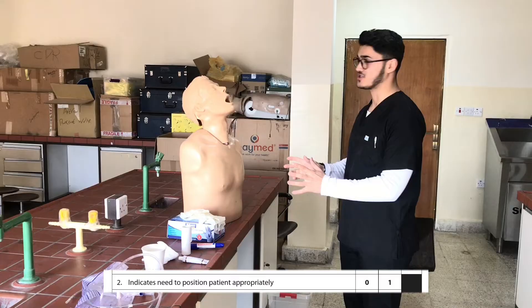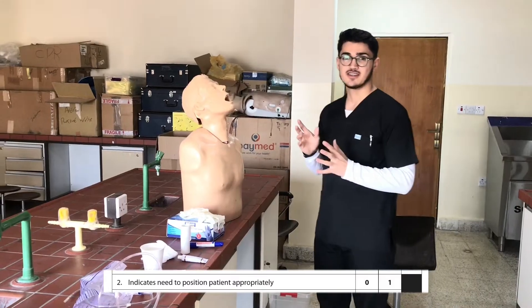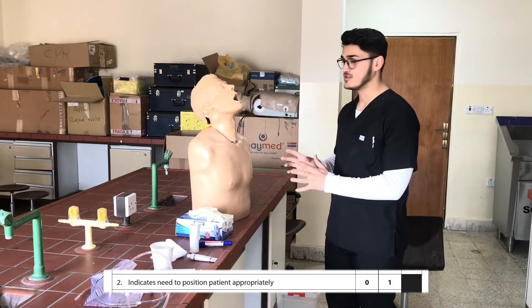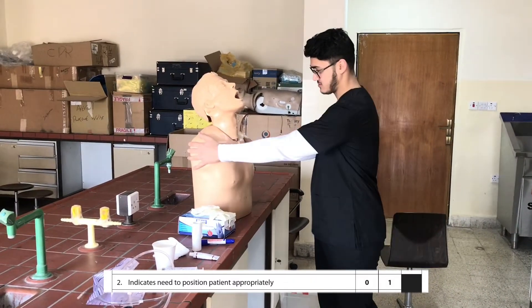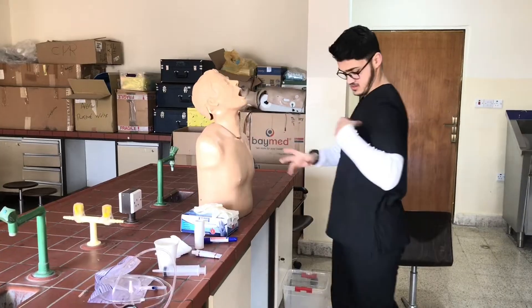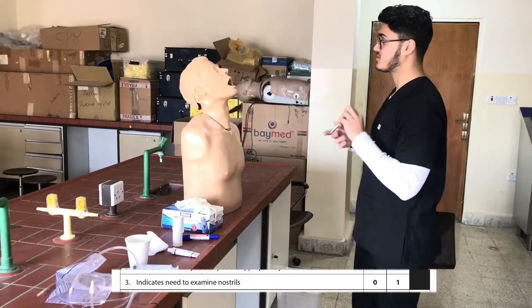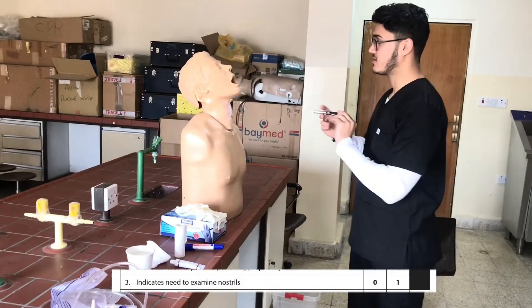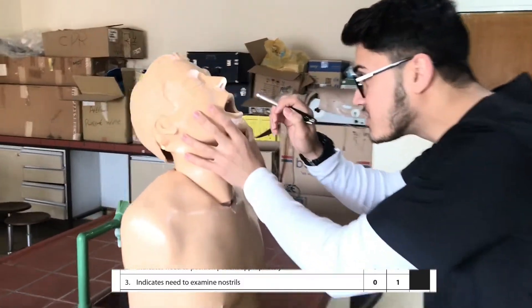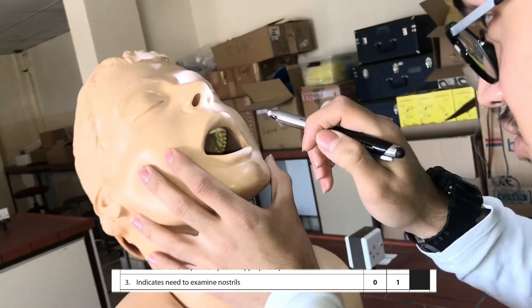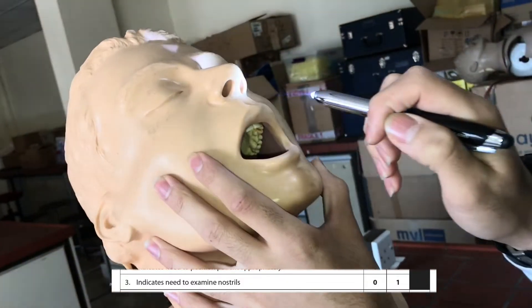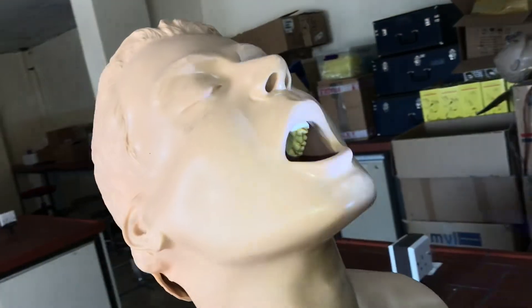After that, I get the patient into the proper position, which is the sitting upright position. Then I check the nostril to see if there's any deviation and decide which nostril is bigger and better for the intubation.